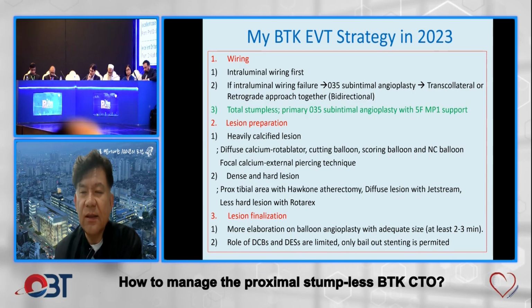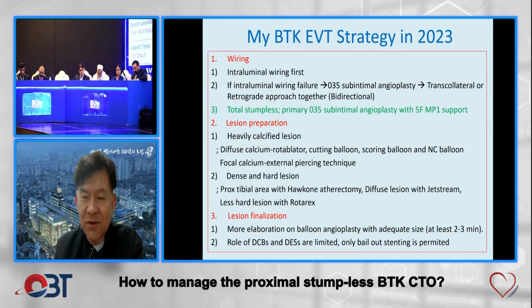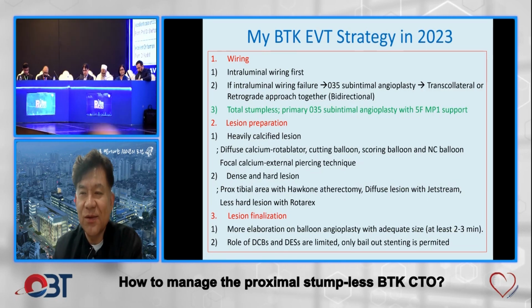Yes, as cardiologists, we can adapt in both extremes. The coronary CTO technique should be adopted in complex peripheral cases, and we can get more inspiration from the coronary to peripheral, and the peripheral safari technique we can adapt to the coronary CTO. Either can be adapted. So that's true. I'm very happy with that.